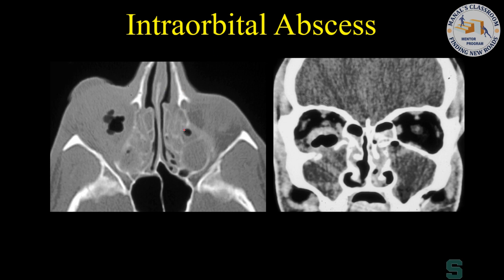So another example of an intraorbital abscess, this case was an older case, but I'll never forget this. I don't know about how it's in Egypt, but all bad things happen on Friday afternoon. So Friday afternoon is the day before our holiday, so I guess it's Thursday afternoon for you, right?